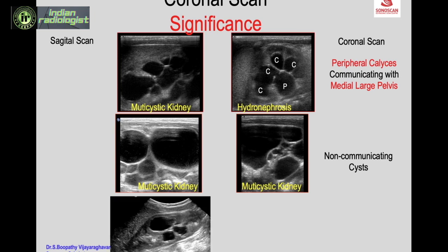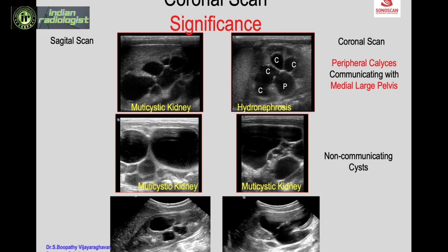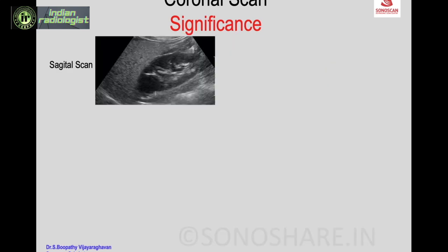Another example: you see multiple cysts in the lower half of the kidney on sagittal scan, but on coronal scan the upper half is normal, while the lower half shows peripheral dilated calyces communicating with the medially placed renal pelvis continuing as the ureter. This makes the diagnosis of hydronephrosis of the lower moiety in a double collecting system with the upper moiety being normal — a diagnosis possible only on coronal scan.